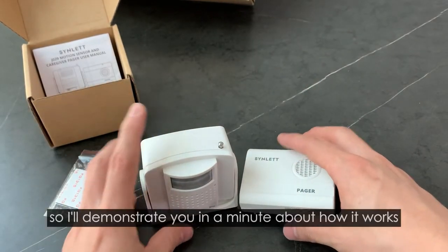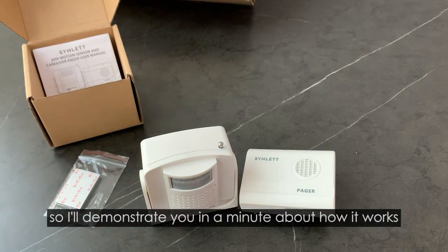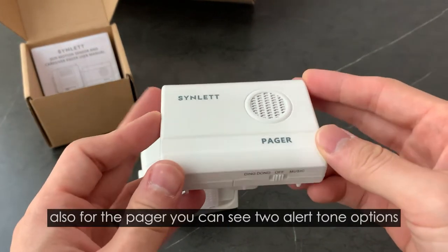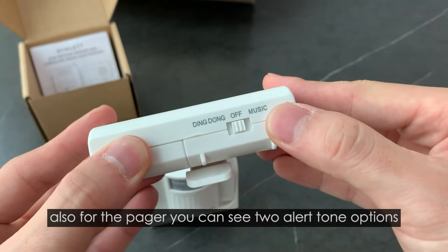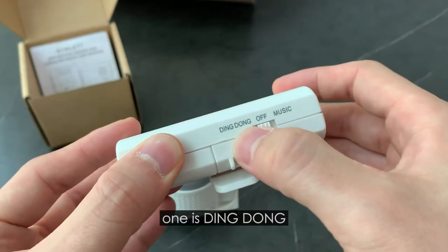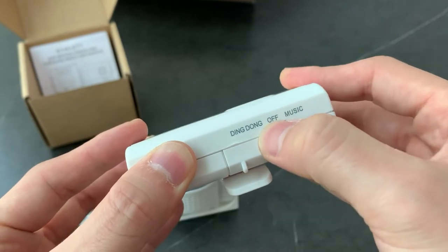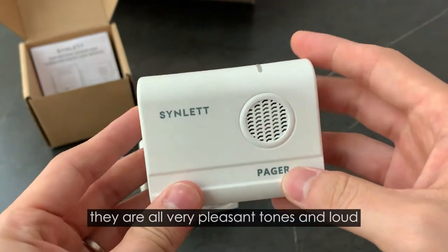I will demonstrate to you in a minute about how it works. Also for the pager, you can see two alert tone options. One is ding-dong, the other one is a music chime. They are all very pleasant tones and loud.